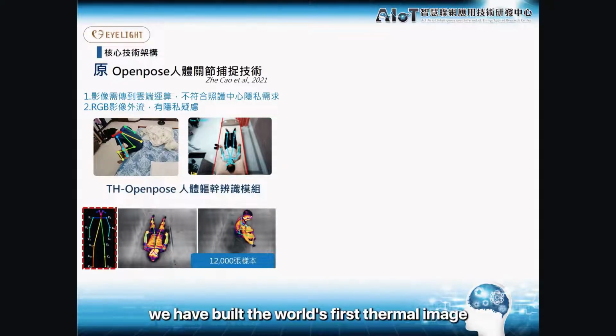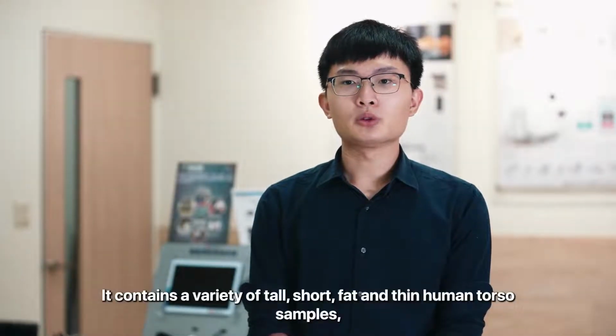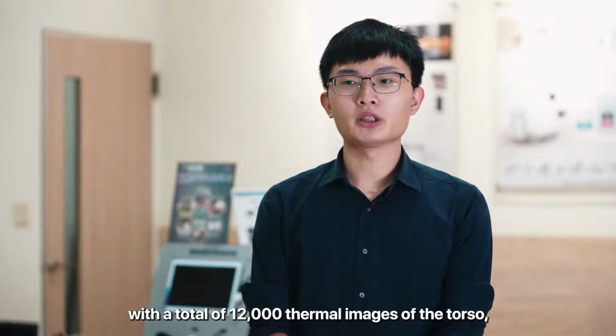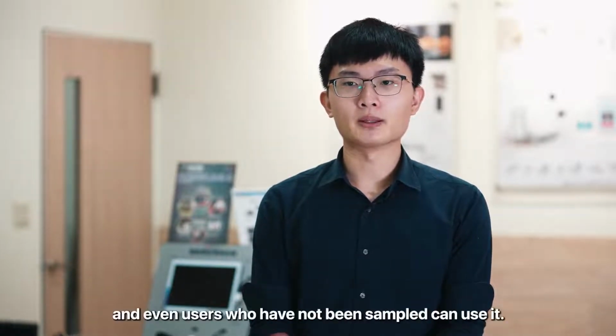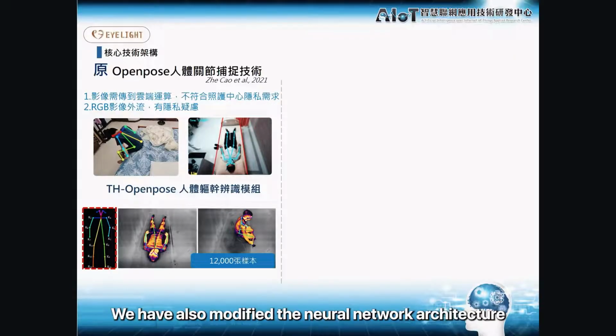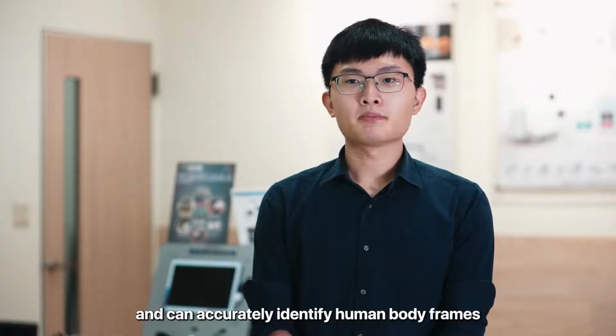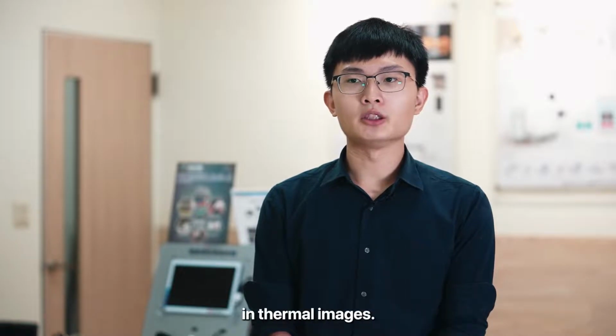Therefore, we have built the world's first thermal image torso identification dataset, namely the TH OpenPose Human Torso Identification Model. It contains a variety of tall, short, fat and thin human torso samples, with a total of 12,000 thermal images of the torso, and even users who have not been sampled can use it. We have also modified the neural network architecture of the native OpenPose module, which we call TH OpenPose Lite. It can achieve real-time operation in edge computing devices, and can accurately identify human body frames in thermal images.